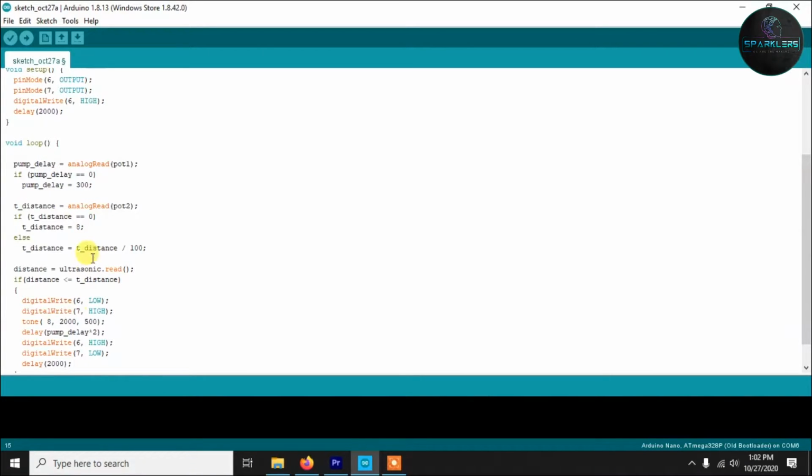Finally, the loop. Here what we are doing is reading the port 1 value, so the potentiometer 1 value, into pump delay. Now pump delay means the delay for how much time the pump will pump out the sanitizer. So depending on that, you will get the amount of sanitizer. Okay, so we are reading the value now. Like I said, the value will be between 0 to 1023. So basically here in pump delay we will get a value from 0 to 1023.